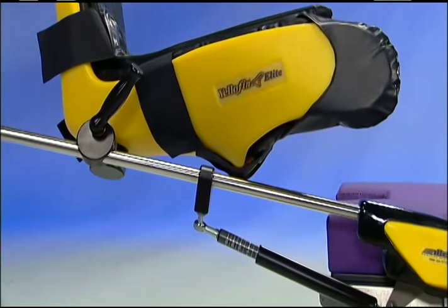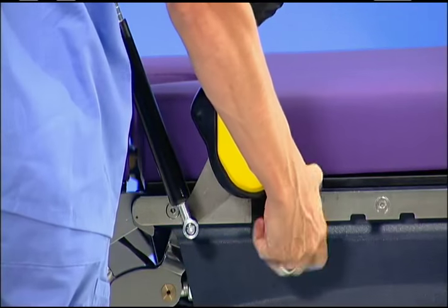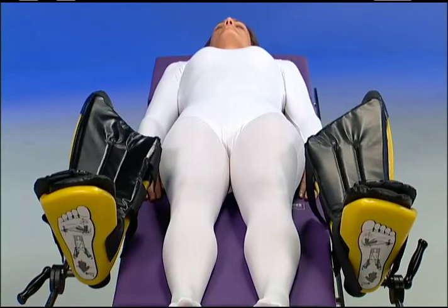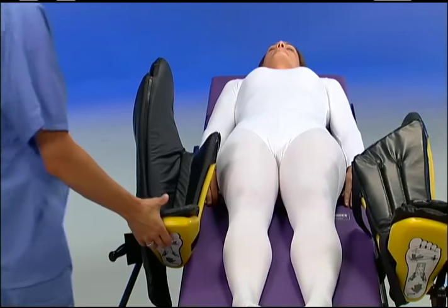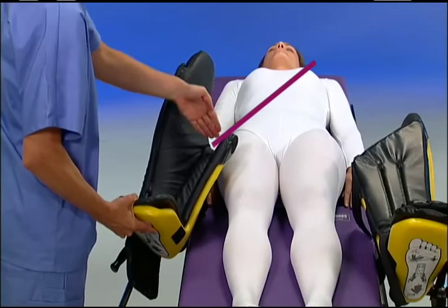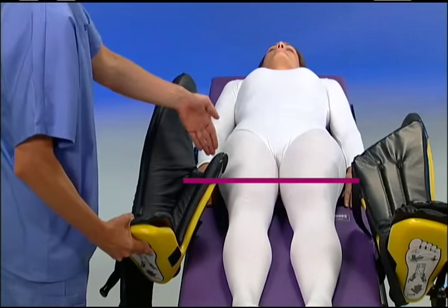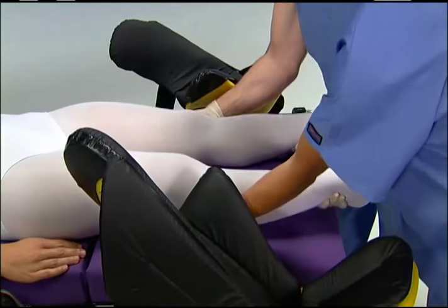Note the markings on the cylinder indicating degrees of lithotomy. Simply drop the flat mounting blade into the rectangular opening of the rail clamp and tighten the rail clamp knob. This blade design prevents drifting and unwanted rotation of the stirrup in the clamp. For ease of patient transfer and to help eliminate personnel lifting injuries, place the stirrup boots as close to the table as possible. To adjust for patient leg length, loosen the boot lock handle and aim the back of the boot at the opposite shoulder. Slide the boot up or down the bar so the back of the boot — not the fin — is even with the knee, then secure the boot, open the pads, and place the patient's legs into the stirrups simultaneously.